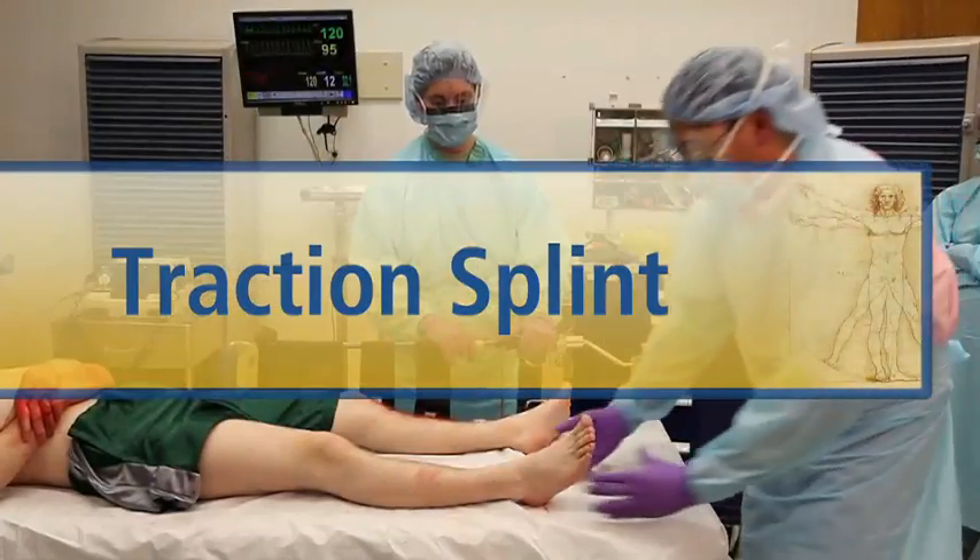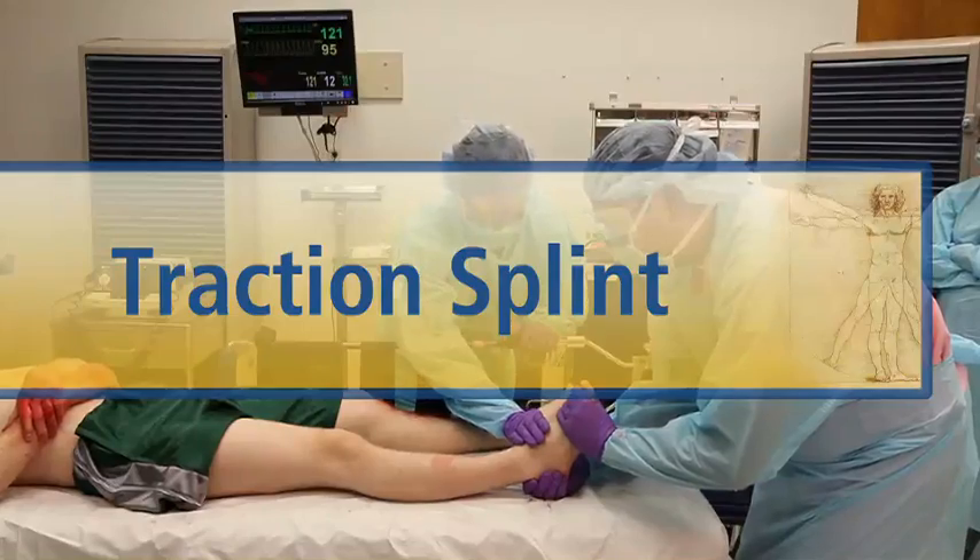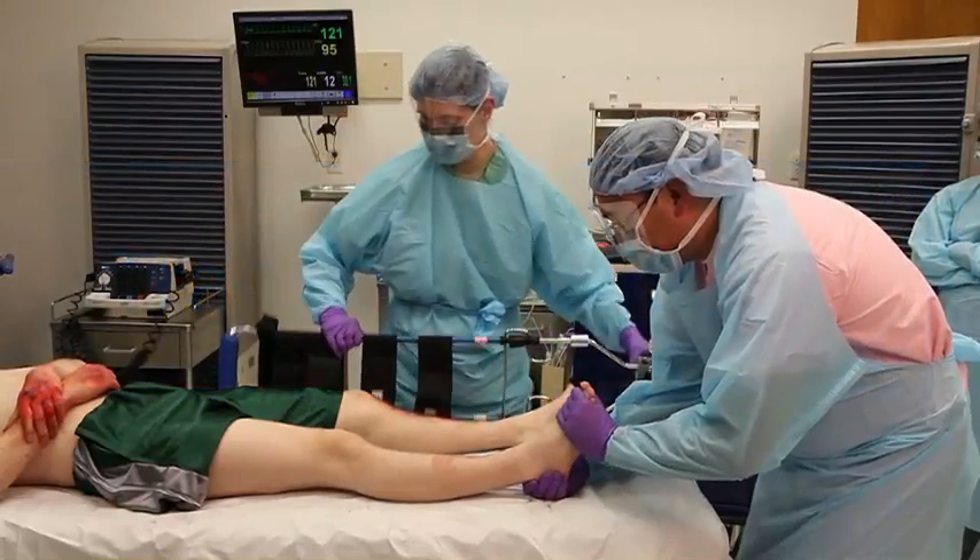It takes two people to apply a traction splint: one person to handle the injured extremity, and the second to apply the splint.